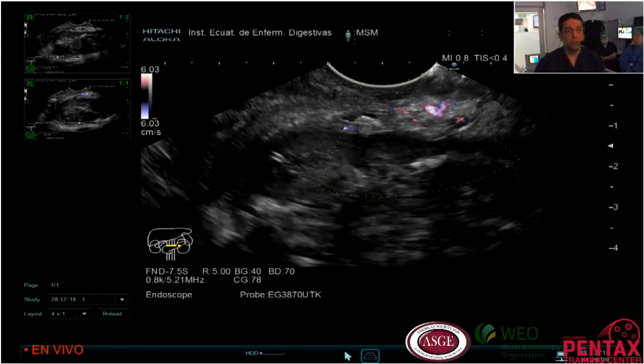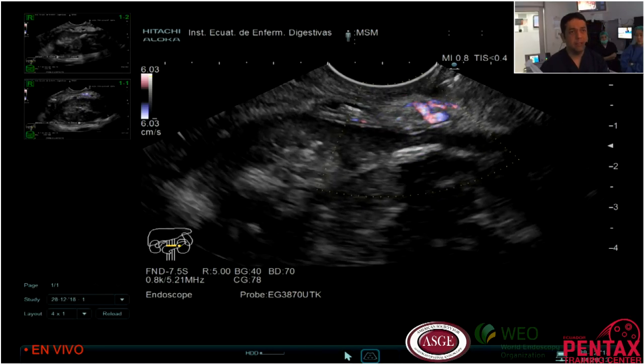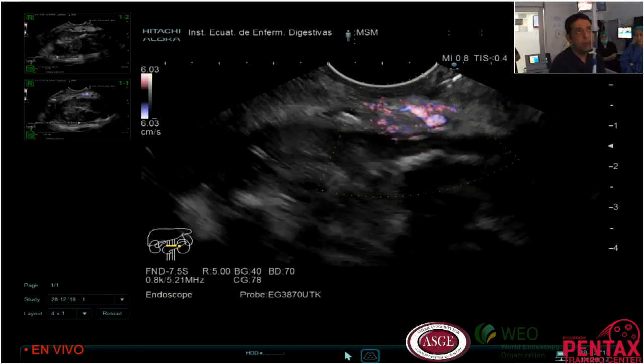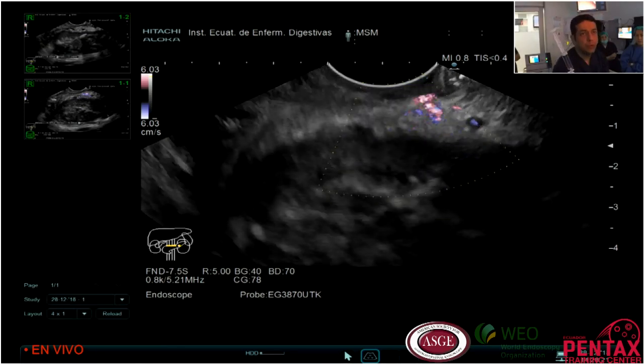So I will try to have a good access, and I will try also to avoid my vessel. So the only way is this.